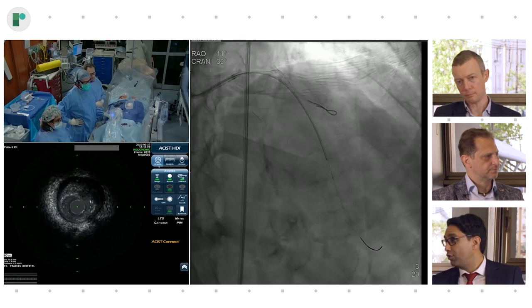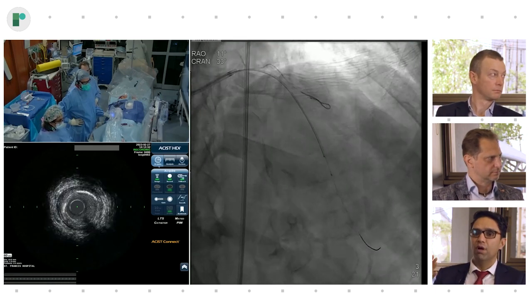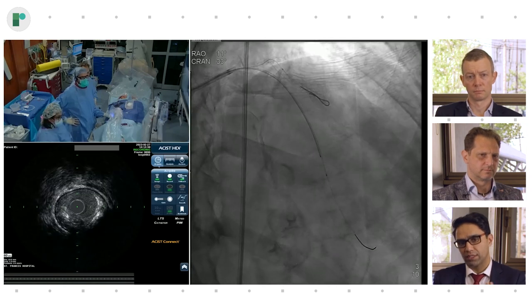Exactly. Because especially when you do a fast pullback, right? For me, who's using 10, it's flying through. I can't stop on that frame. So this at least mitigates that strategy. And that's especially why we use it for ultra low contrast cases.